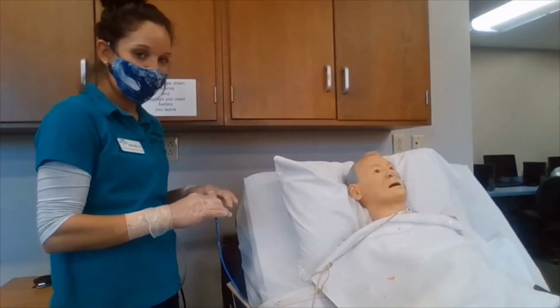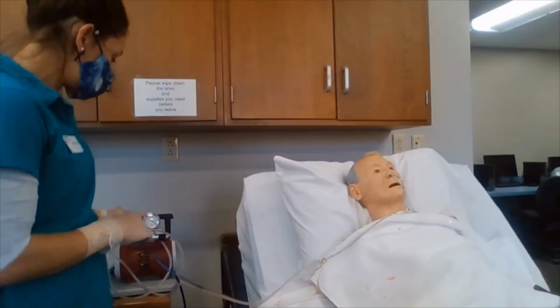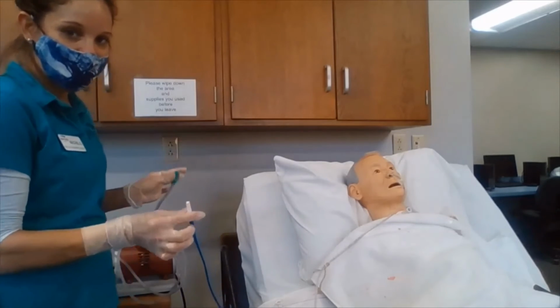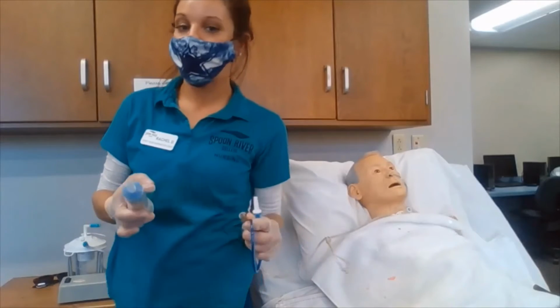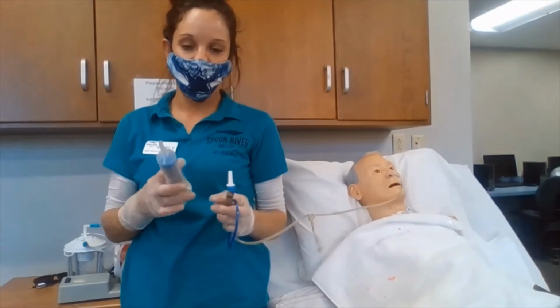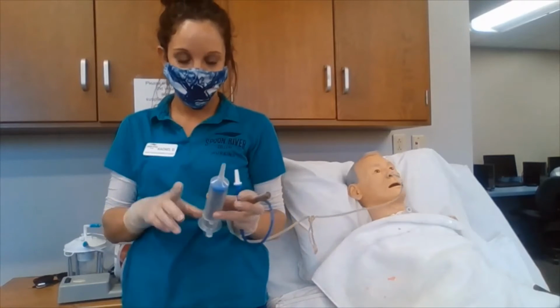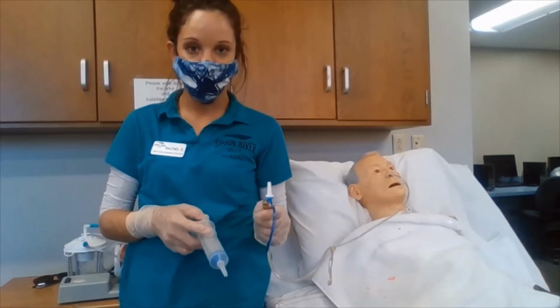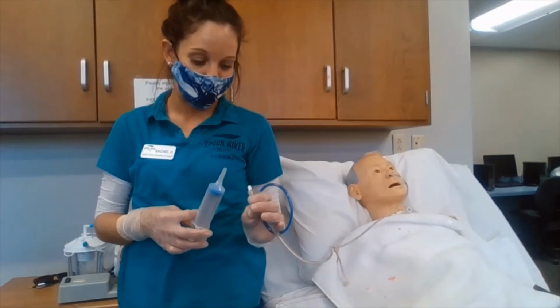First thing we're going to do is we are going to turn off our suctioning device here. We are going then to disconnect the tubing. We are always going to be telling our patient what we are going to be doing and explaining the procedure, explaining some of the symptoms like gagging or discomfort while removal.